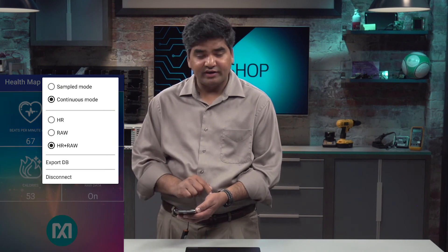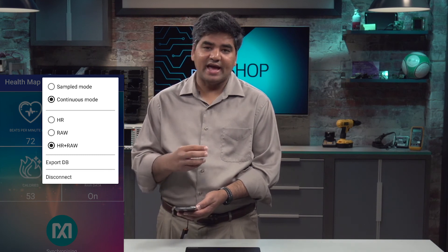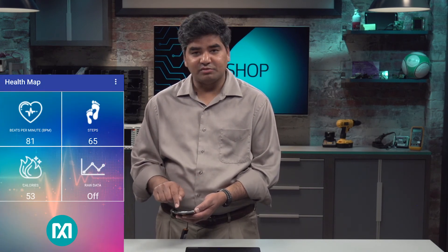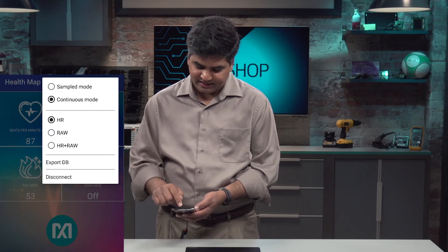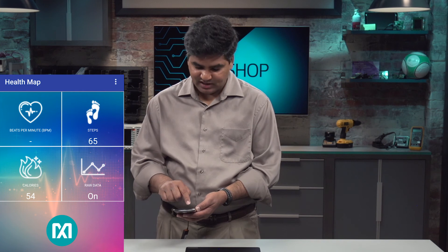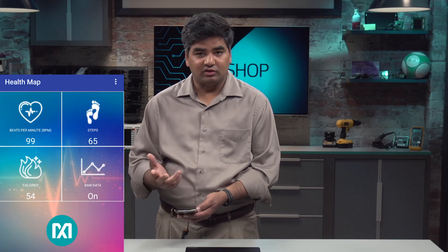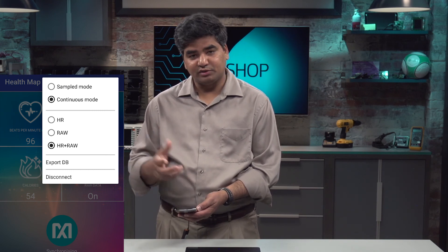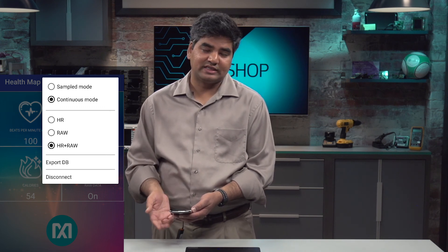At the bottom, there are three different options: HR, Raw, and HR plus Raw. HR is the algorithm output only — if you select heart rate, the raw data option switches off and you no longer have access to raw data. If you're only interested in raw data, the raw data box switches on and the algorithm output goes off. Or you can select both — it's completely flexible. You can also export the database if you want to post-process or evaluate the data offline. The last option is disconnect, if you want to disconnect the Healthband from the mobile app.